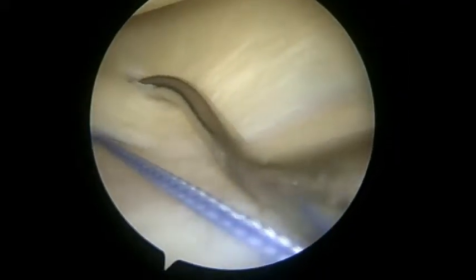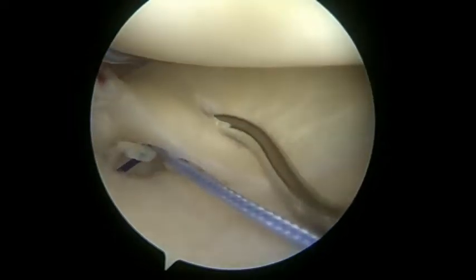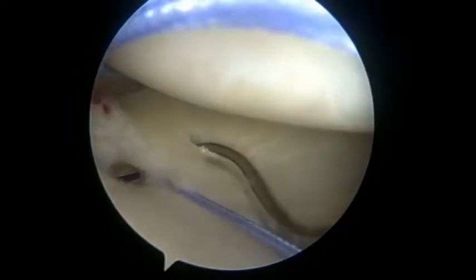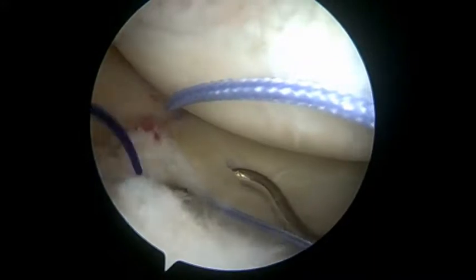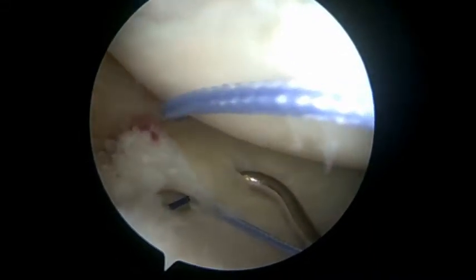We then prepare to create our horizontal mattress by shuttling a PDS through the meniscus more centrally. This is then grasped and pulled out of the medial portal, similar to the first PDS.